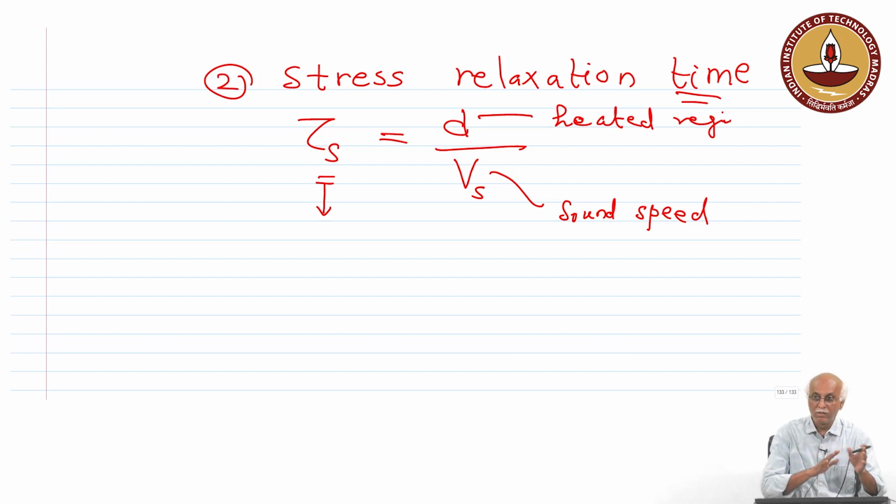As the pulse width is large, thermal diffusion will also be large, so the nearby tissues will also get affected by the temperature increase. So generally the laser pulse width or modulating frequency should be such that the pulse width of the laser interaction is short enough.